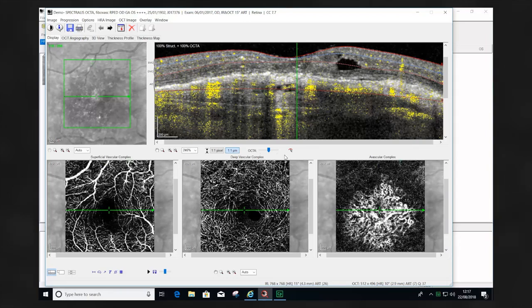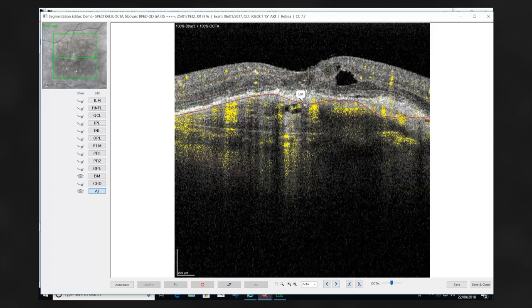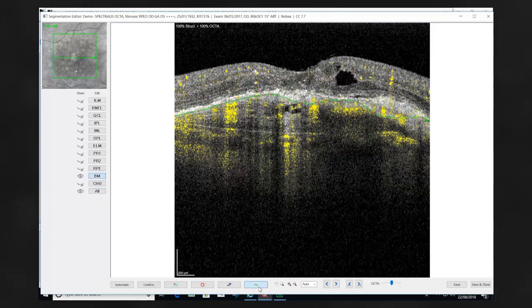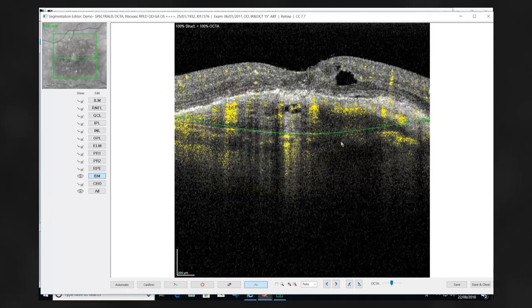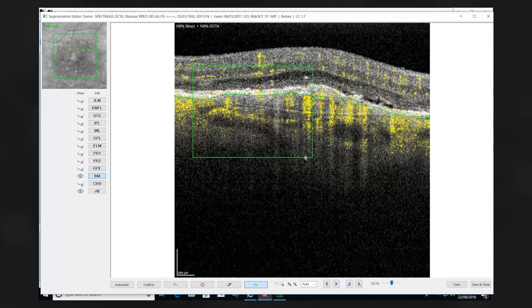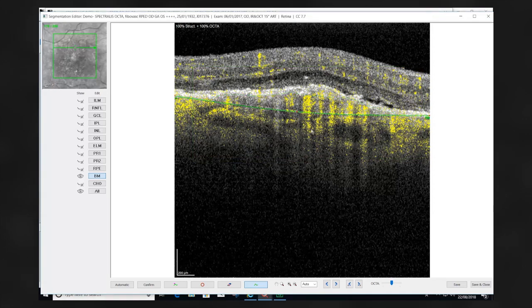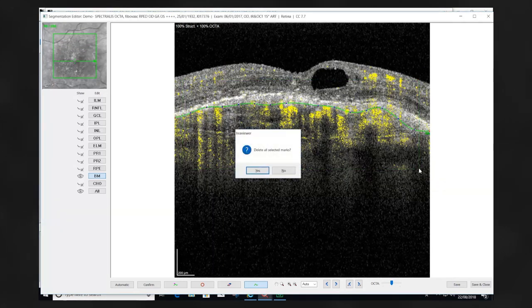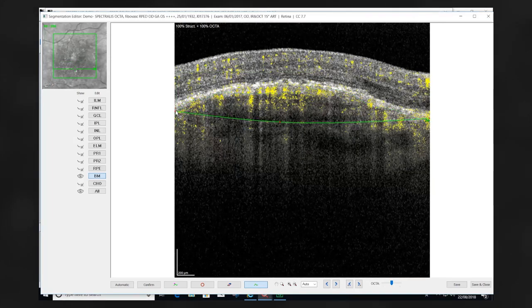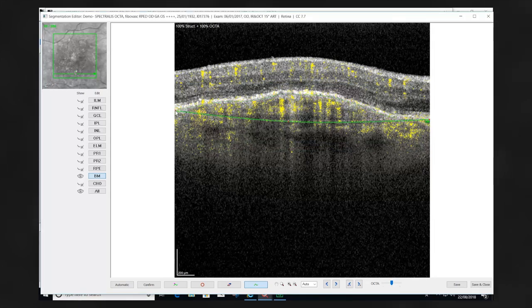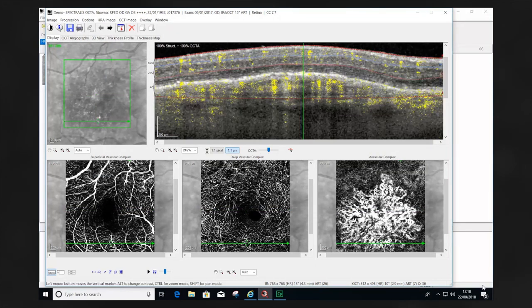The segmentation editing package is opened. The Bruch's membrane position is identified and the node points are edited and corrected for the appropriate position for Bruch's membrane. This process will need to be completed for five to seven B-scans across the whole volume scan. The information and corrected segmentation position will then be propagated providing accurate visualization of the Bruch's membrane position and the true extent of the choroidal neovascularization. The corrected segmentation position can now be visualized and the larger extent of the choroidal neovascularization can now be seen.